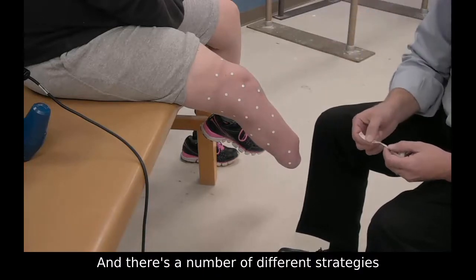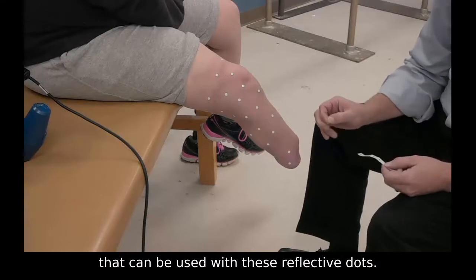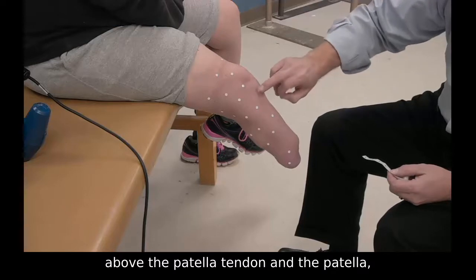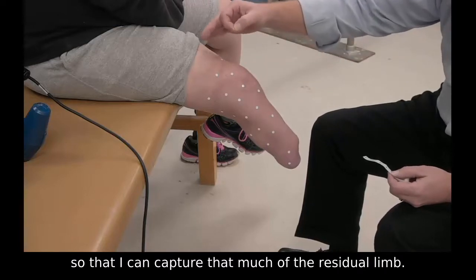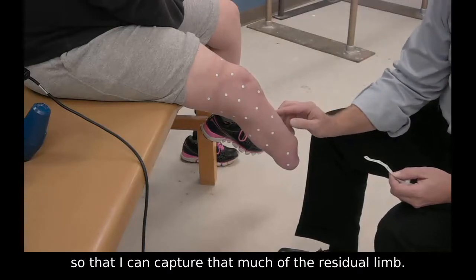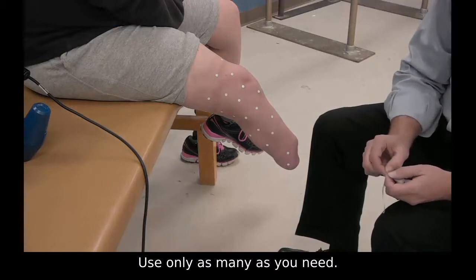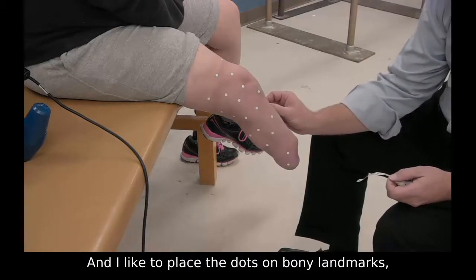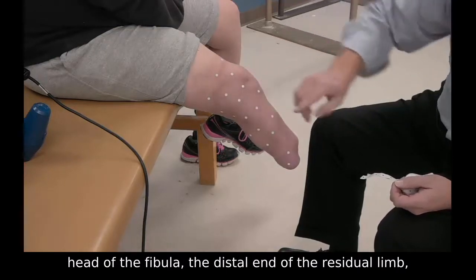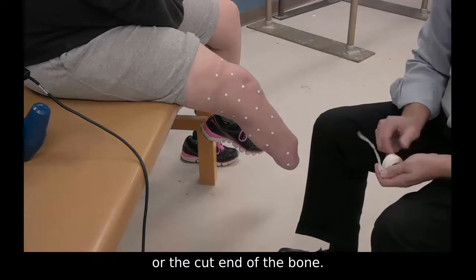And there's a number of different strategies that can be used with these reflective dots. What I like to do is go a few inches above the patella tendon and the patella so that I can capture that much of the residual limb. You want to be about 1 inch to 1.5 inches apart with the dots. Use only as many as you need, and I like to place the dots on bony landmarks, head of the fibula, the distal end of the residual limb or the cut end of the bone.